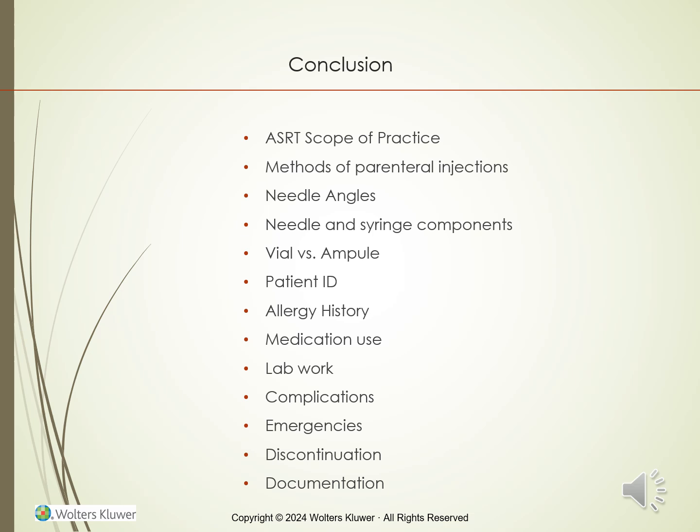Needles are composed of a bevel tip and come in different sizes. Syringes are measured in milliliters and vary in size from 1 to 50 or even larger. Both needles and syringes must be disposed of in proper containers that are labeled for sharps. If a needle stick does occur with a dirty needle, it needs to be reported to employee health immediately and an incident report needs to be filed. Medications come in various different containers, which include vials and ampules, as well as medication bags or multi-use vials.